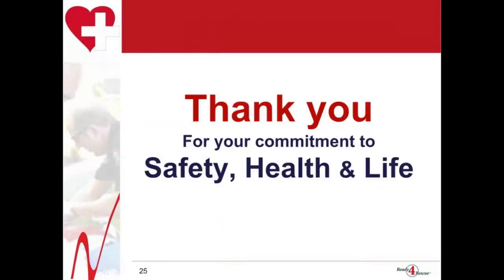Thank you for your time. We hope this video helped familiarize you with the semi-automatic Cardiac Science G5 AED.